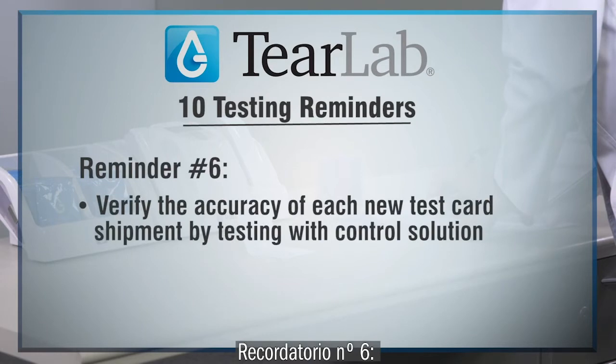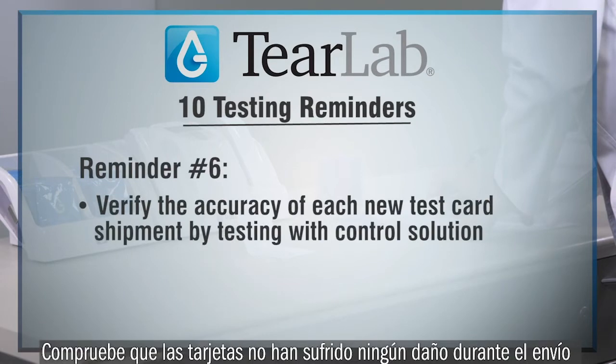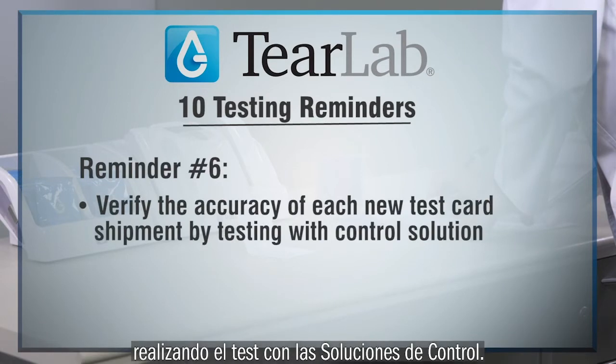Reminder number 6. Verify the accuracy of each new test card shipment by testing with control solution.